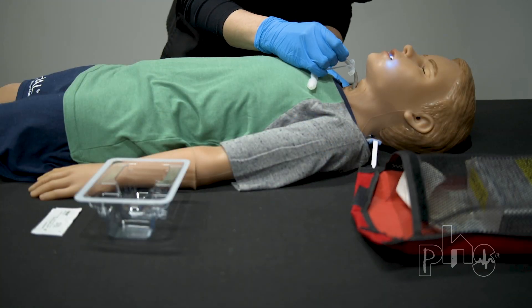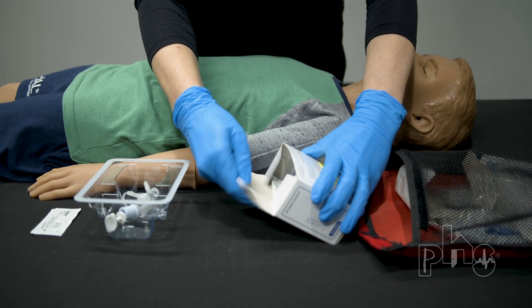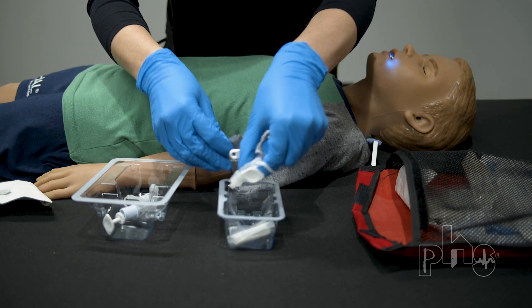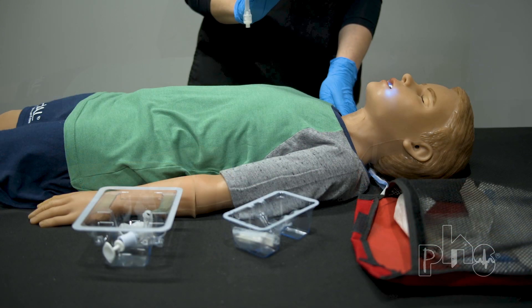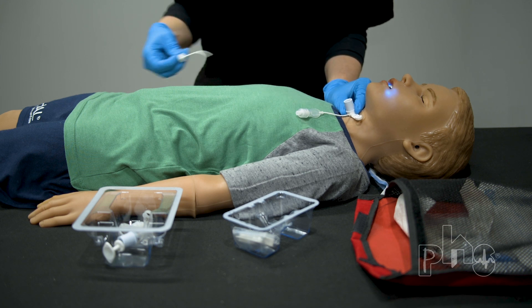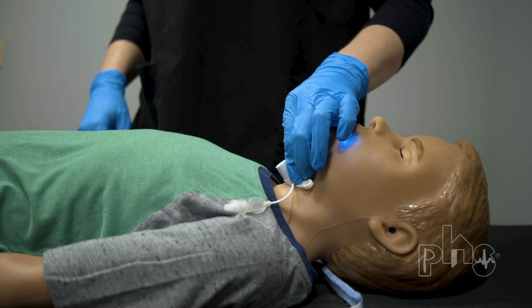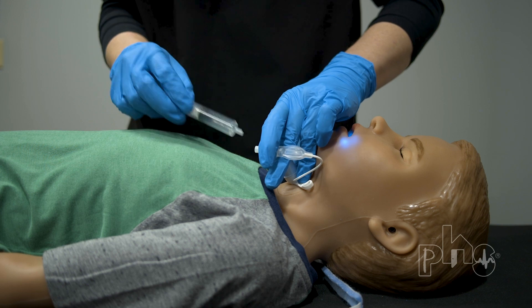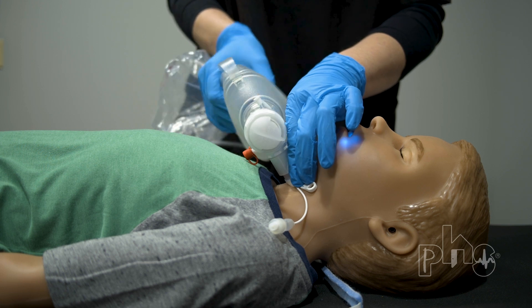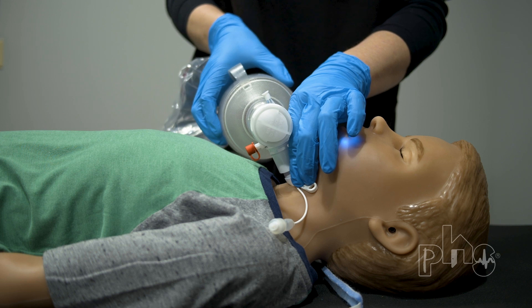Insert the new trach tube into the trach stoma with a motion that follows the curve of the tube. If you are unable to insert the new trach tube, quickly open the size smaller trach tube. Lubricate if necessary and if time allows, then insert into the patient's trach stoma. After inserting the new trach tube, hold the flange with one hand. Immediately remove the obturator with a motion that follows the curve of the tube and set the obturator off to the side. While holding the new trach tube in place, inflate the cuff to the ordered amount if the patient has a cuffed trach. Then attach the resuscitation bag to the trach tube and squeeze the bag firmly and repeatedly. Look at the patient's chest to see if it rises each time you squeeze the bag.